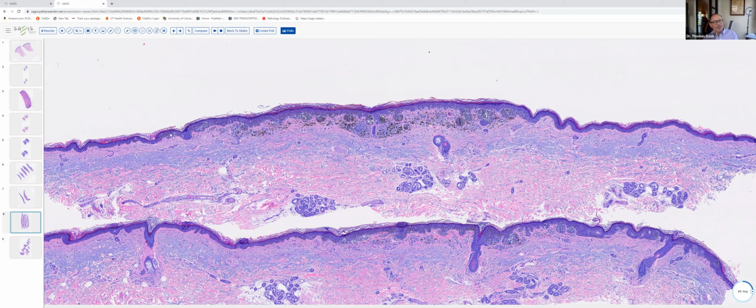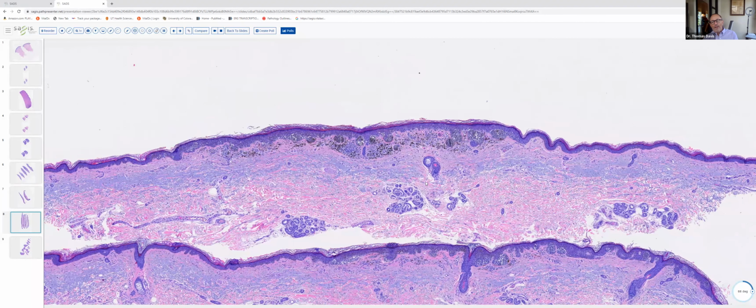It was poorly circumscribed, so we like to assess size. Circumscription, you can see that there are solitary units of melanocytes that tend to trail out to the periphery. So it's not real sharply circumscribed, and it's somewhat asymmetric. We have a bunch of big nests over in this half of the specimen, but a lot of solitary units over here.